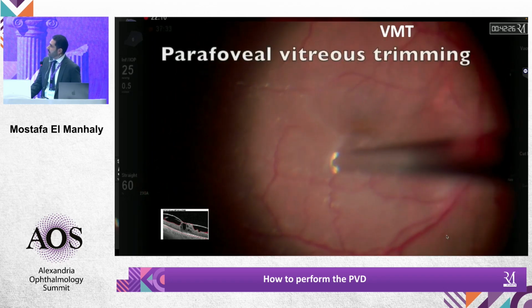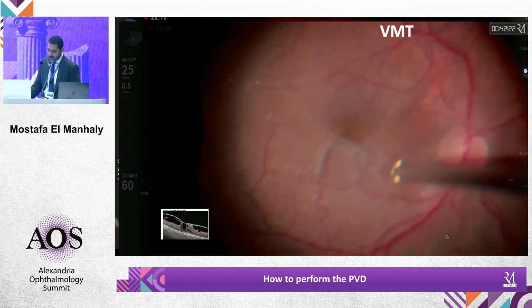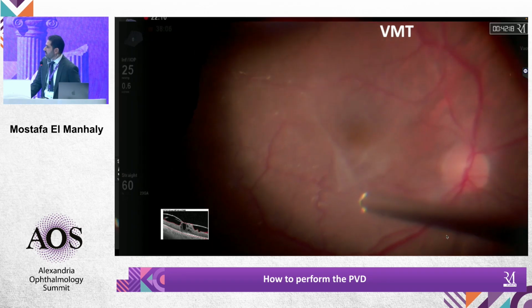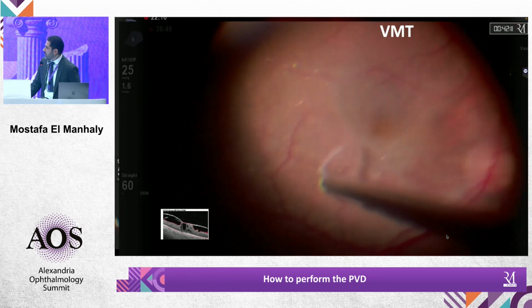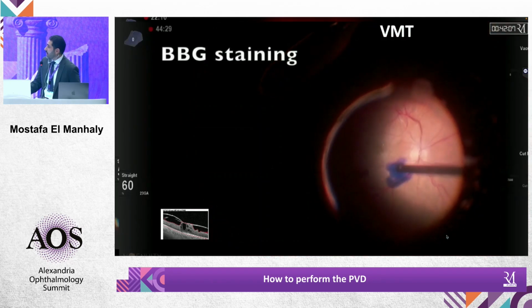Okay. In this case, do we have to remove these remnants or friable vitreous over the fovea? Do you need it, or is just separating it enough? Just separating it. There is no need to detach the stump attached to the fovea. And no need to do an ILM in this case. No, I do an ILM.